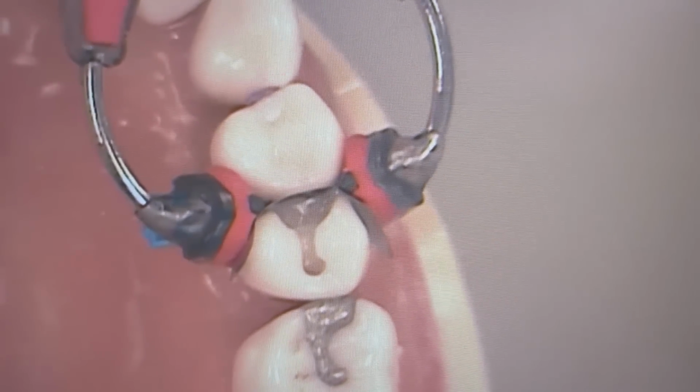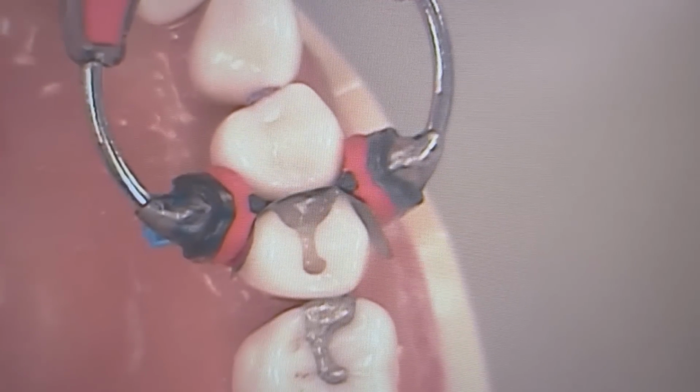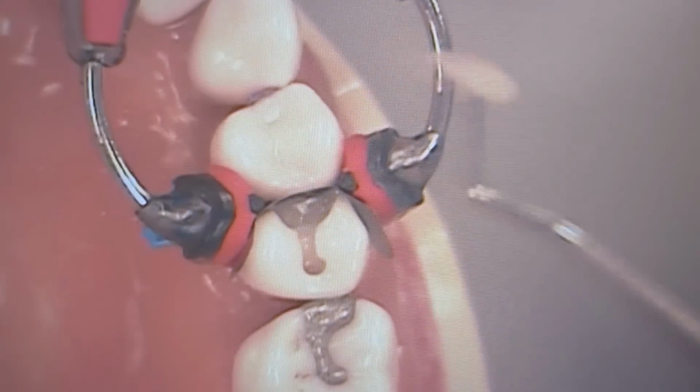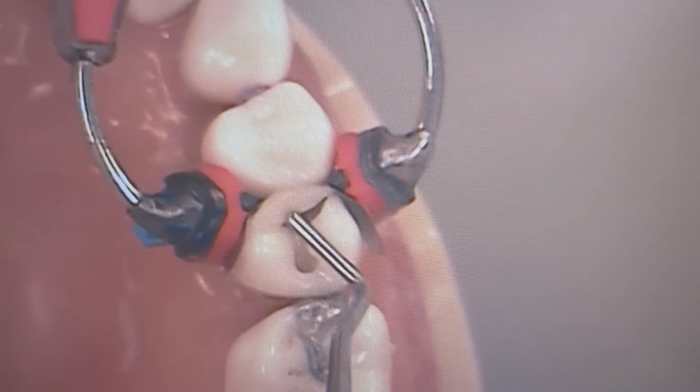Now I'm going to go to the marginal ridge. Now he's going to put on the marginal ridge. That's flat right now, up to the pulpal floor. Marginal ridge? Now it's doing marginal ridge. Pay very close attention to this part.